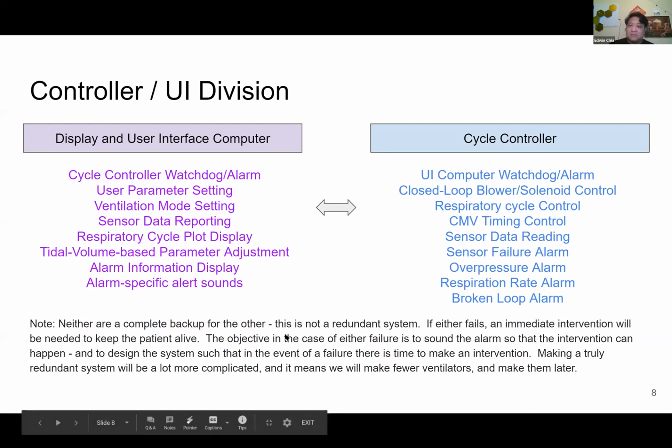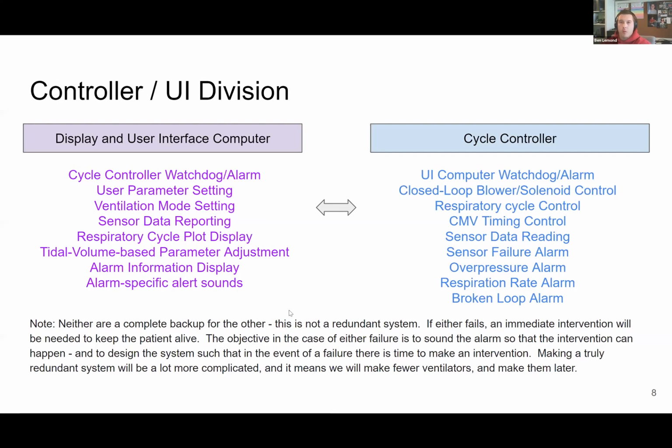It would be possible. Yes. Ben Lamond here. Real quick, one idea for that might be to keep a designated pin in hardware for each of those boards set and always defaulted to high, basically as a redundant default failed state. So every time that thing gets turned on, it's in a failed state. So no matter what, that thing can't start working inadvertently and sending anything to the patient without it being set to true or positive. Yeah, so what you're describing is essentially a watchdog timer, right? I'm saying have that pin default into a failed state in hardware on boot up without even being set by software. Certainly, and then it needs to be reset every so often. And if you don't receive a reset within a certain time frame, it goes back to failure. Yes, that's correct.